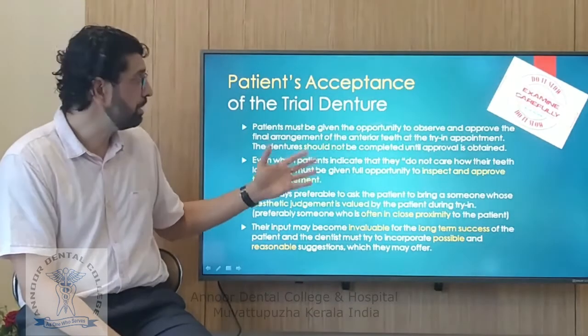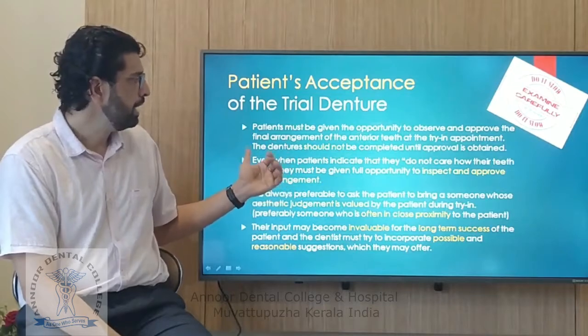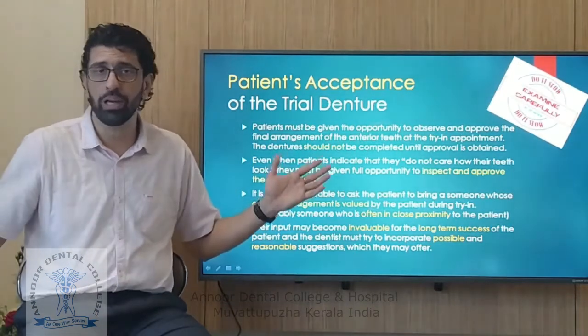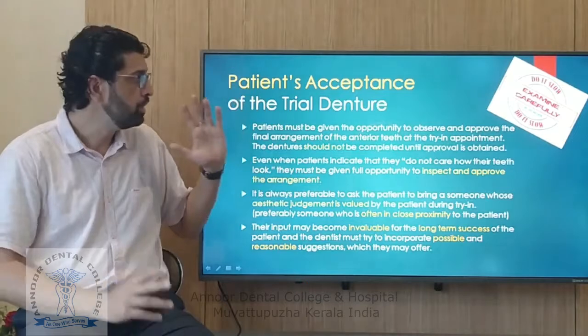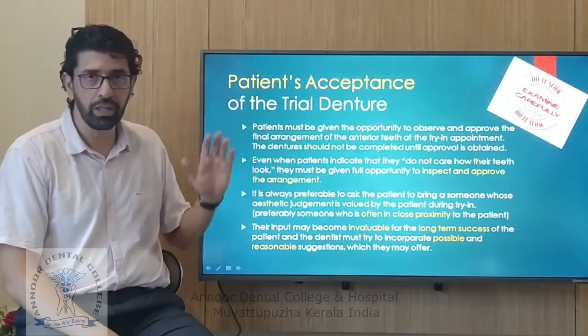You should never complete your dentures until you get a final approval from the patient. Even when the patient indicates, I don't care how it looks, whatever it is fine with me, don't take it for granted. Give them a full opportunity to inspect and approve the arrangement.